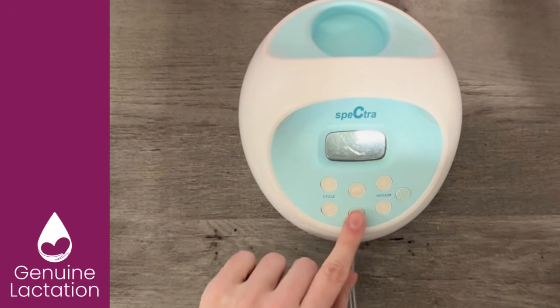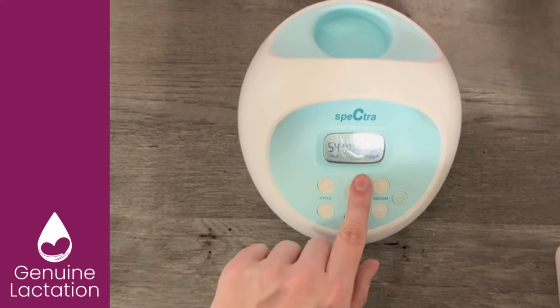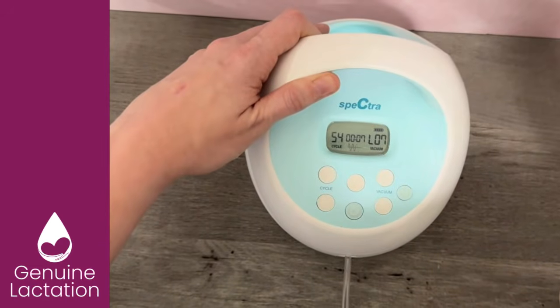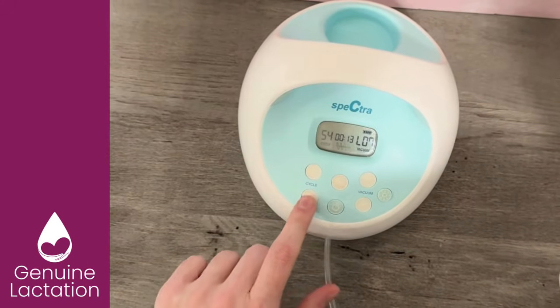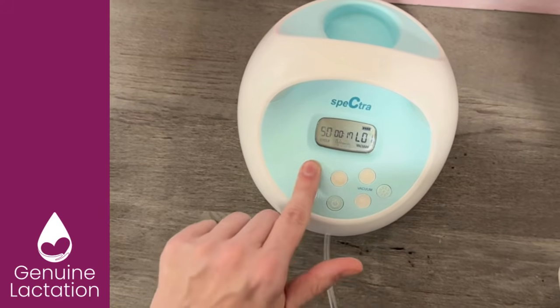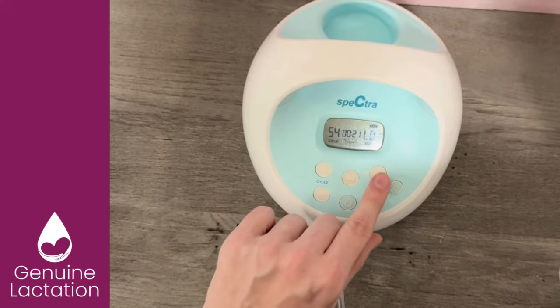So the way that you're going to use this pump is you're going to turn it on. It does come on in the last settings you use. Let me see if I can get that to focus just a little bit better. Sorry, that screen's at a bad angle. So it comes on at the last settings you were using, and what you're going to do is turn it down. Cycle speeds actually go all the way up. So start on 54 for expression, and then lowest vacuum.